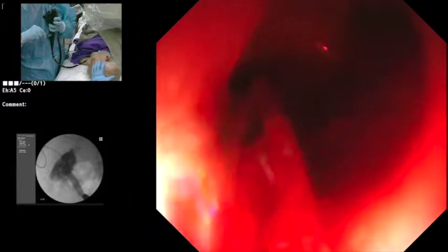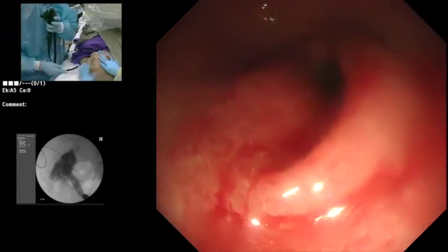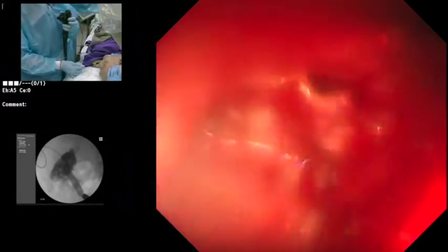It is lumen opposing, it is anchoring, but we still want to be careful. All right, so now I'm going to advance forward, and let's take a look. Now remember, this is a very inflamed gallbladder. Let's get the water pedal, please, for a second.